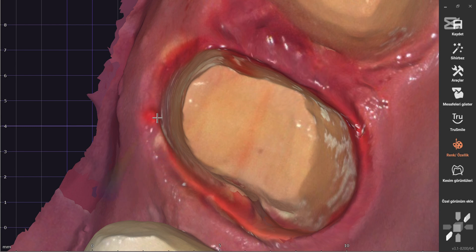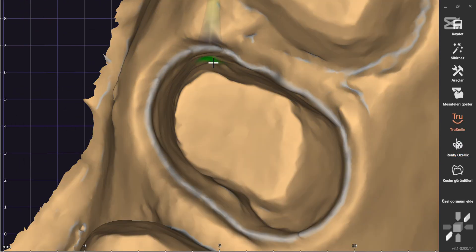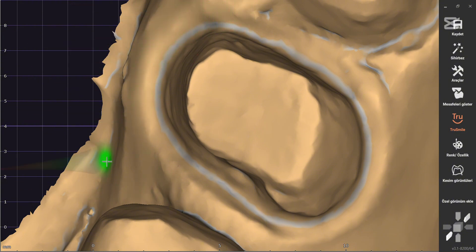First, we carefully examine the digital impression in hand. Checking the accuracy of the impression and ensuring there are no missing details or errors is crucial. Small errors during scanning can lead to major issues in the design process. Therefore, the first step is to thoroughly evaluate the impression.